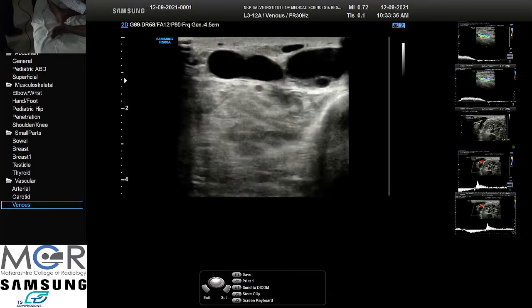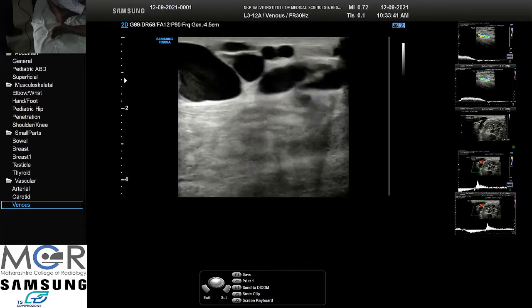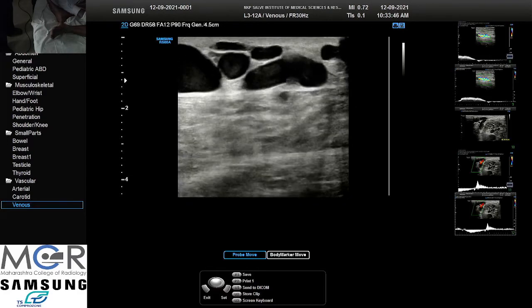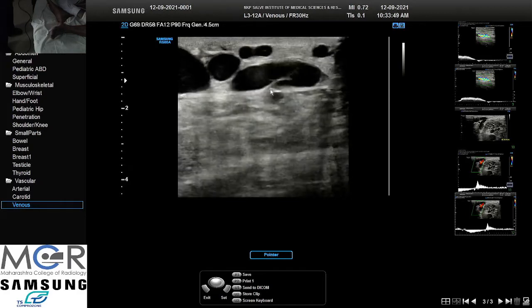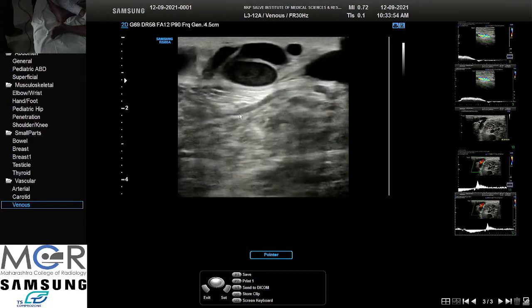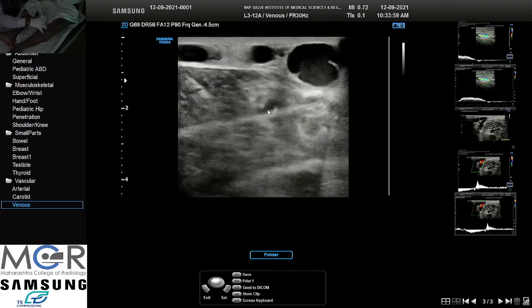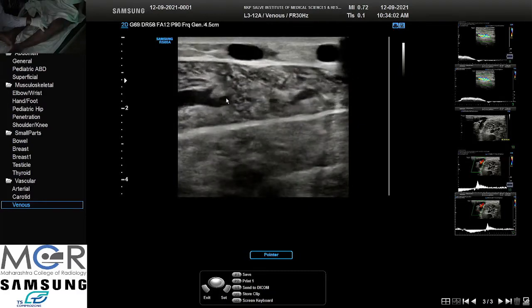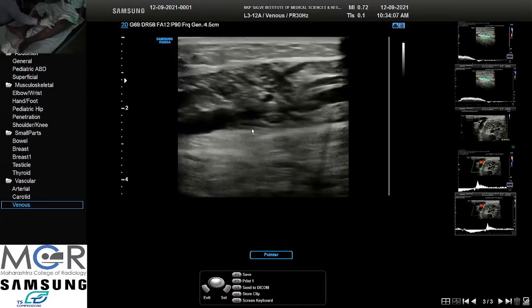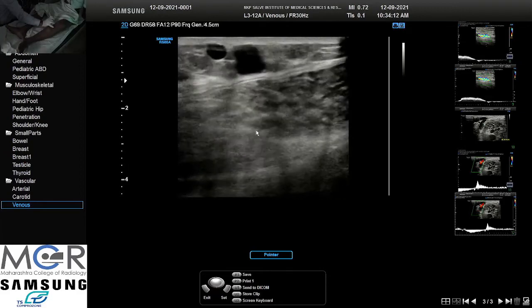So here at one more point it is piercing. This is a point where it is piercing again, one more perforator. You can see it is going in the muscle. So the direction is not described. It finds its own way. See, there is large perforator. They are quite large. They are going posteriorly.